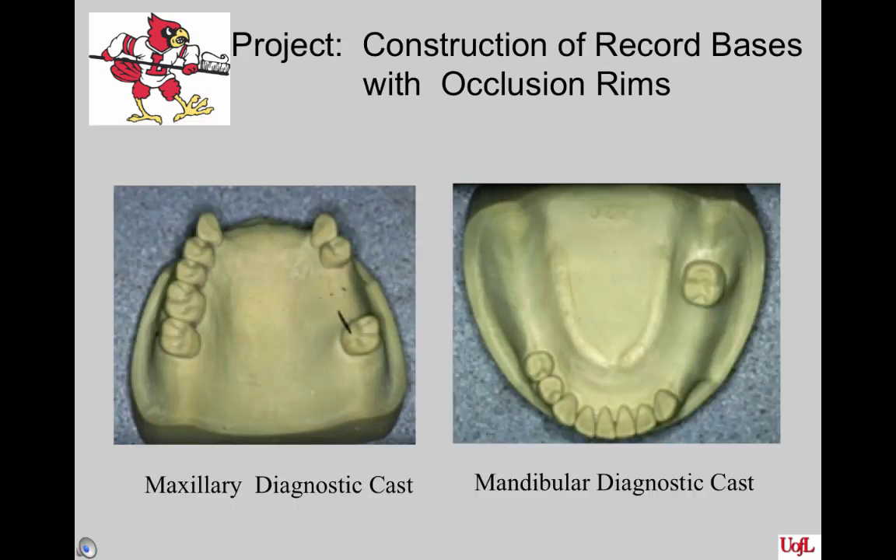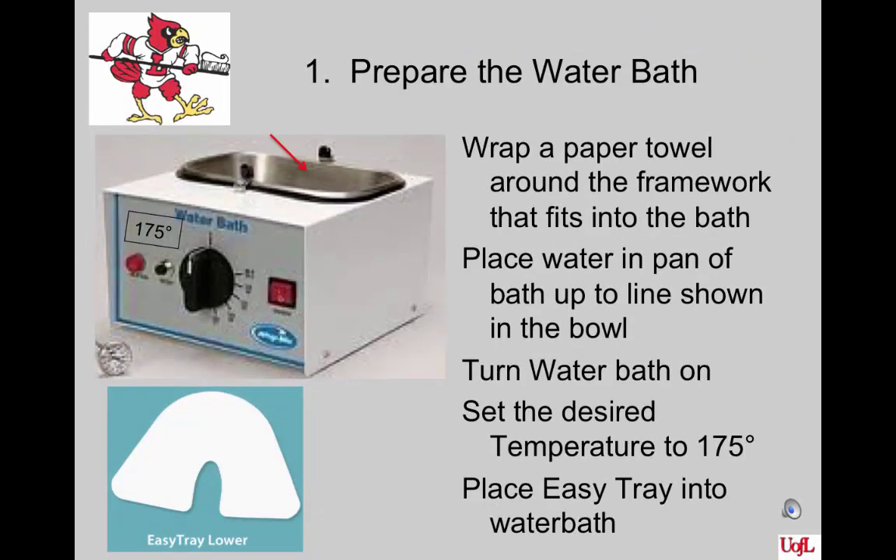What you need to work on for this project is your diagnostic cast made from your two dentiforms. First, get the water bath started so the material will be ready when you are. There's a paper towel wrapped around a little framework in the water bath — make sure it's in place. Fill the pan with water to the marked level, turn the water bath on, set the temperature to 175 degrees, and place your Easy Tray into the water bath on the paper towel.